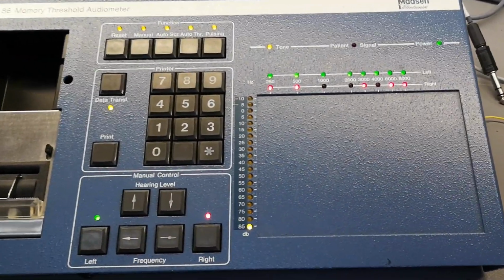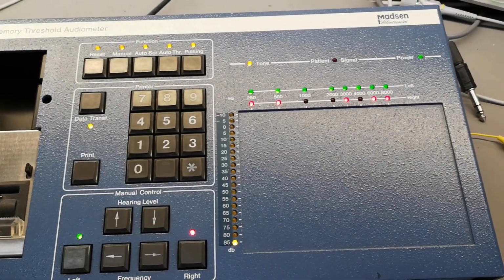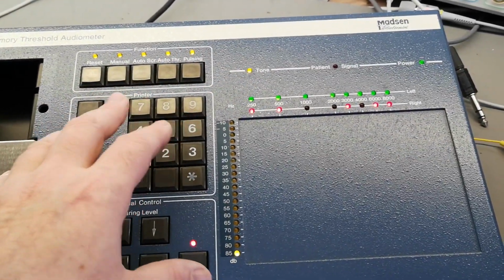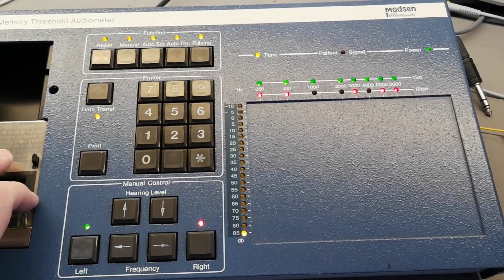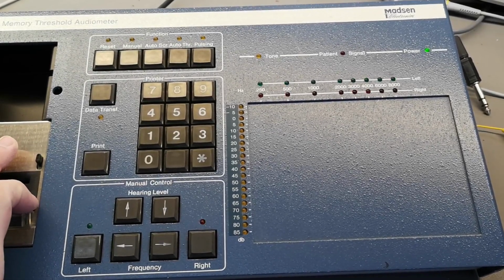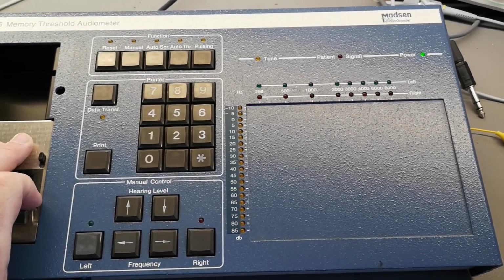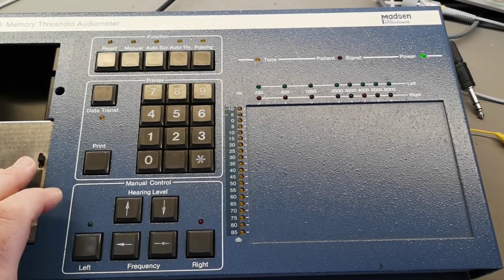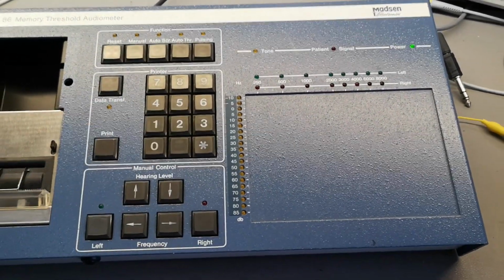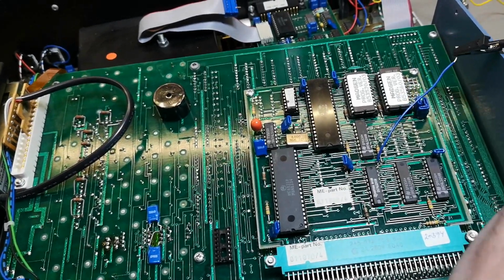See, as you can see now, I got a lot of LEDs alive by turning the power on and off. So I can prove that I can set, or I can confuse some of the output register that's driving all the LEDs and stuff. But see, beep, and then that is it. Yeah, I disconnected the printer so I think there's no life in the CPU. So you gotta see this. The CPU is actually alive.